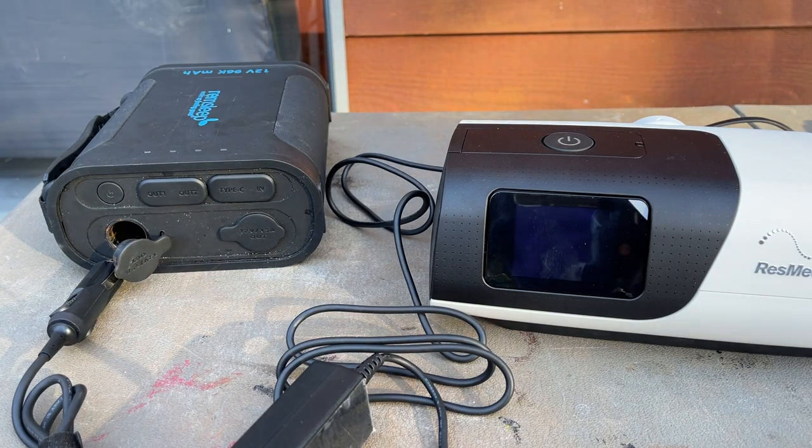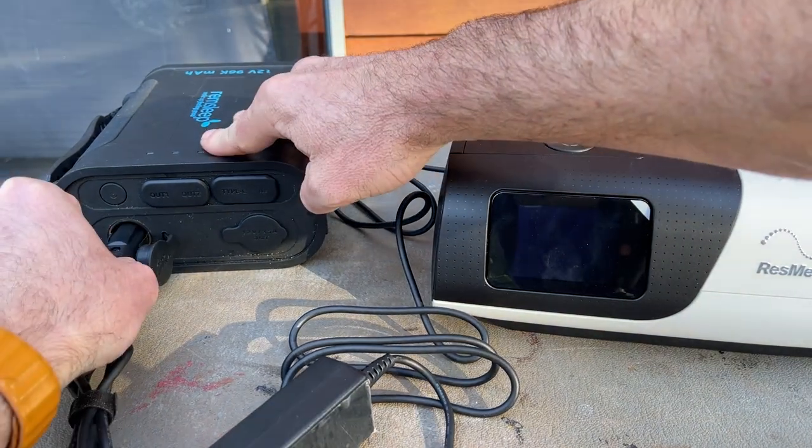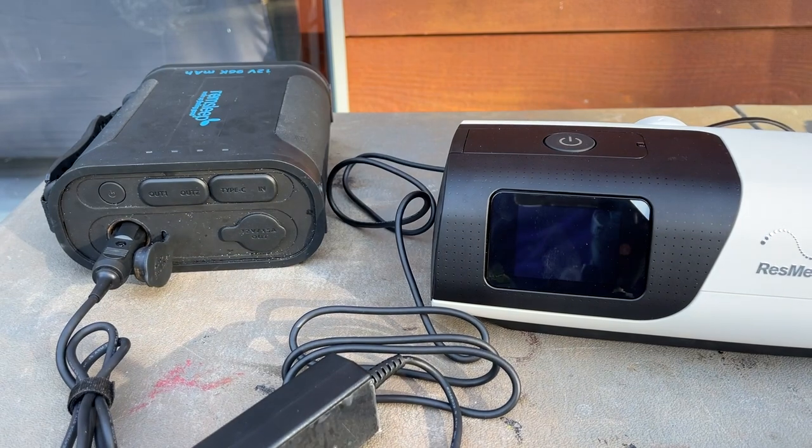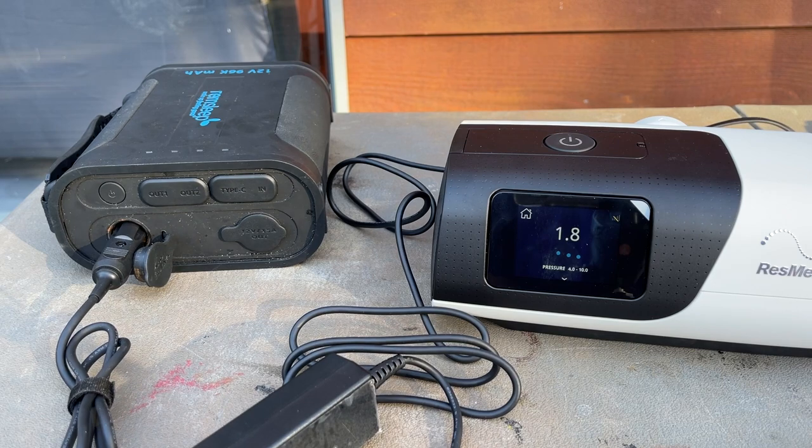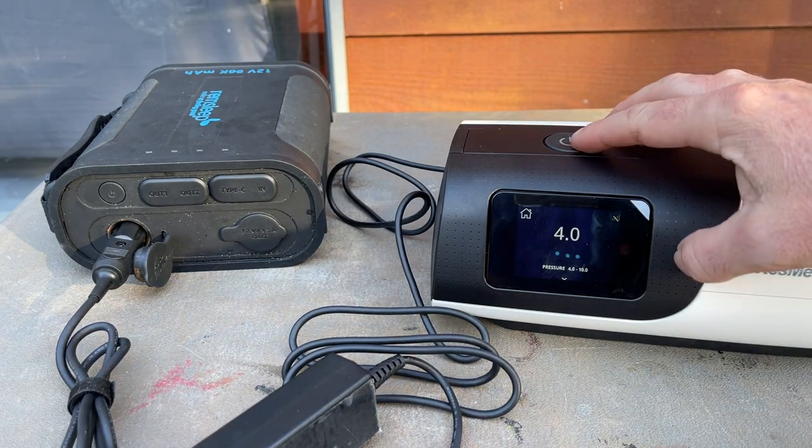And now the moment of truth — here we go. Great stuff.